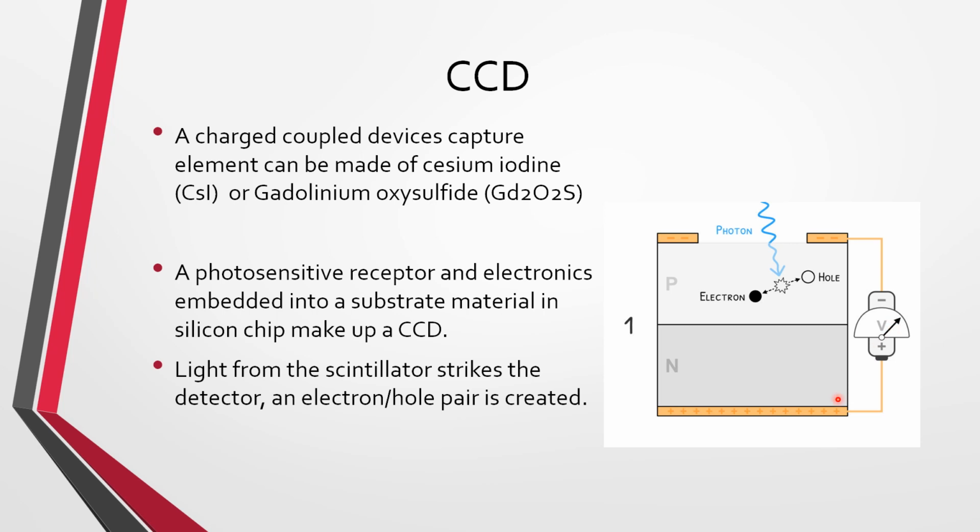This is detecting a voltage, and that can be interpreted as a signal of an image, as a digital X-ray image. The electrons are read out to form an image. So that's the very basics of that technology. Energy comes in, creates an electron-hole pair, and then that is read out as a signal.